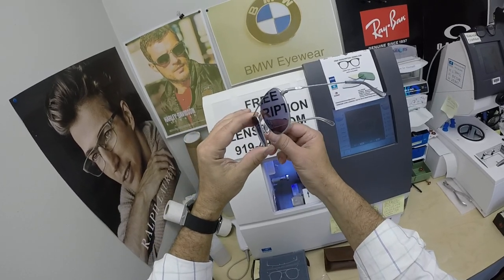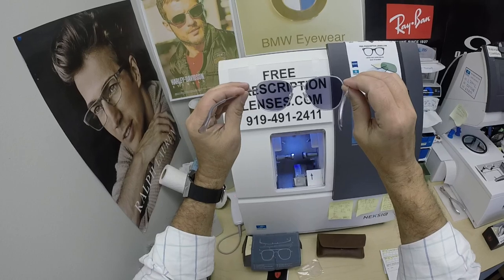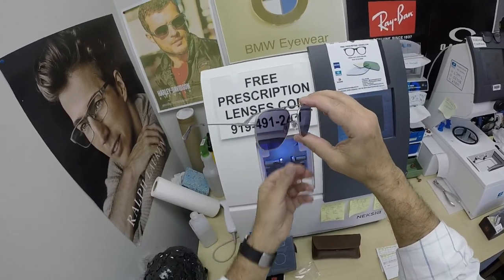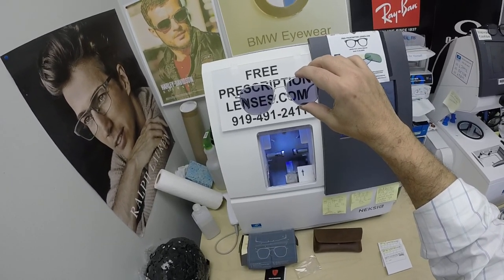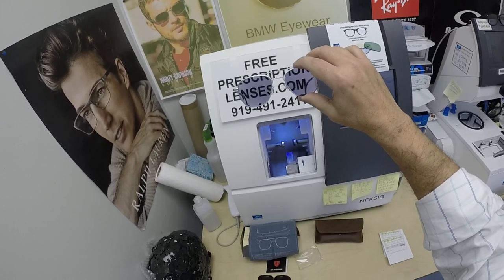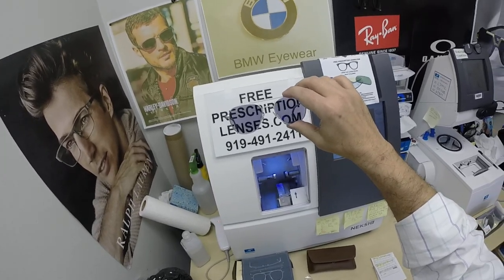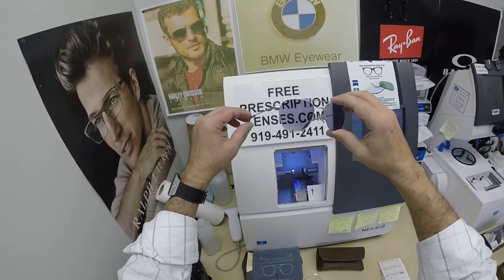I remind everyone: when it's 100 degrees outside, you're miserable, they're miserable. Nobody or nothing works 100% when it's 100 degrees outside — we all work much better when it cools off. Now having said that, Zeiss does offer the Photofusion Extra Gray that gets extra dark in extra hot weather. It's designed for extra active people who spend a lot of time outside, or if you just want the darkest lens possible or you live in a hot climate, that might be the way to go.